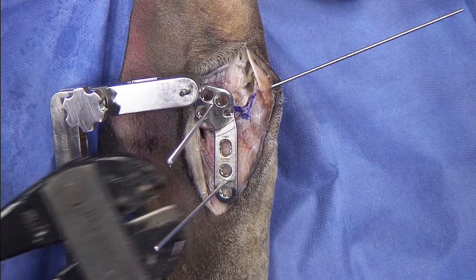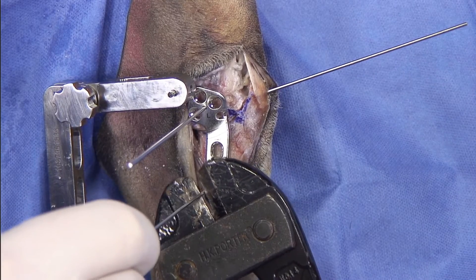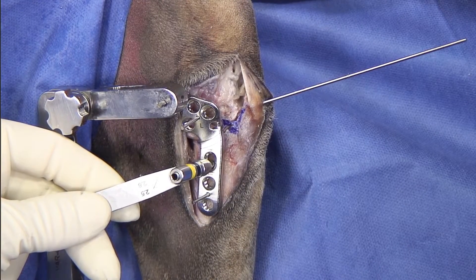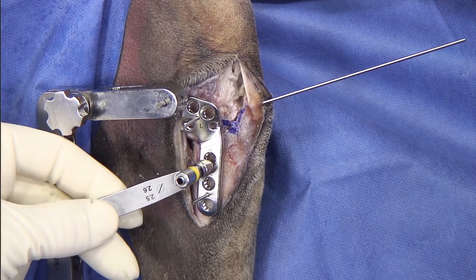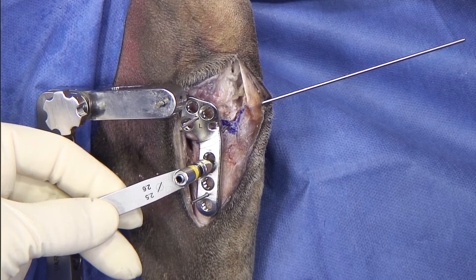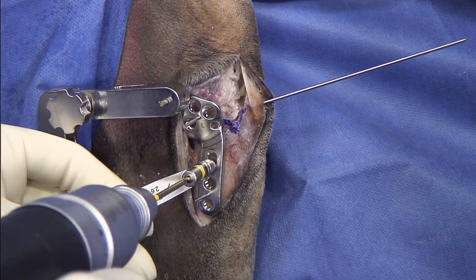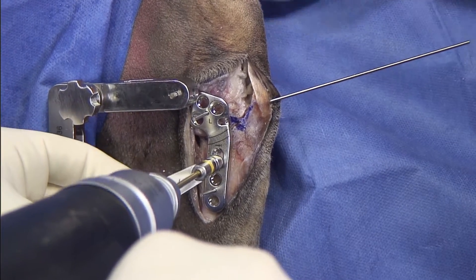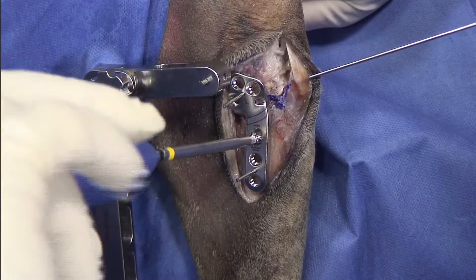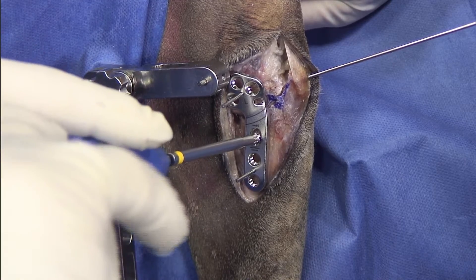If I'm happy about the position, I can go ahead and cut the K-wire a little shorter. The first screw that we are drilling is the most proximal screw of the distal fragment. We want to place this screw in a loaded position, but we're not going to tighten it all the way down. This screw is going to provide more stability to the plate. These are self-tapping screws — again, I'm not going to tighten it all the way down.